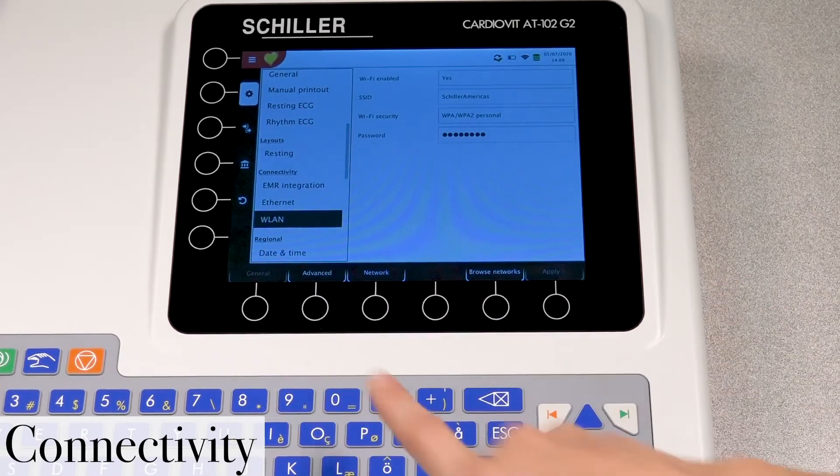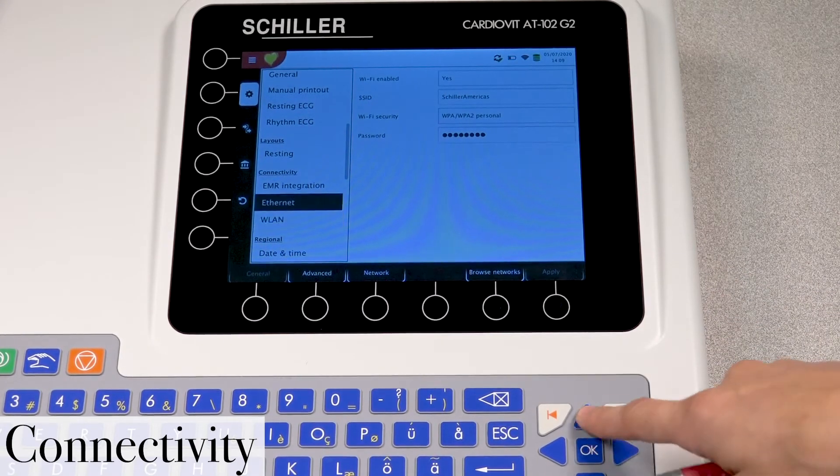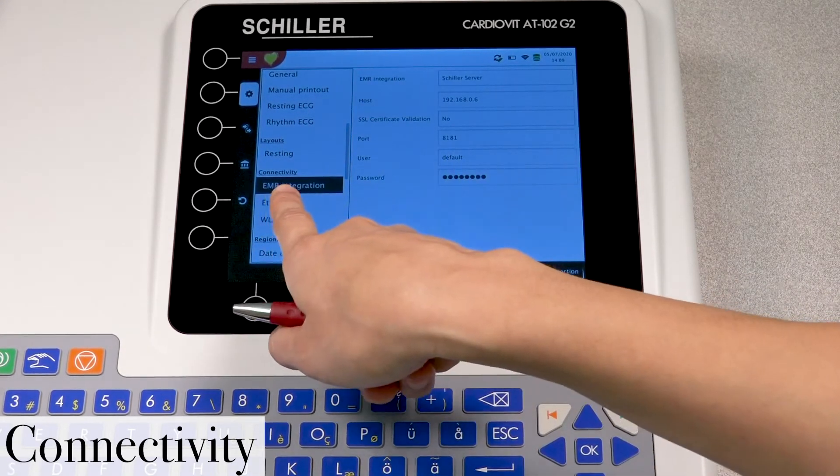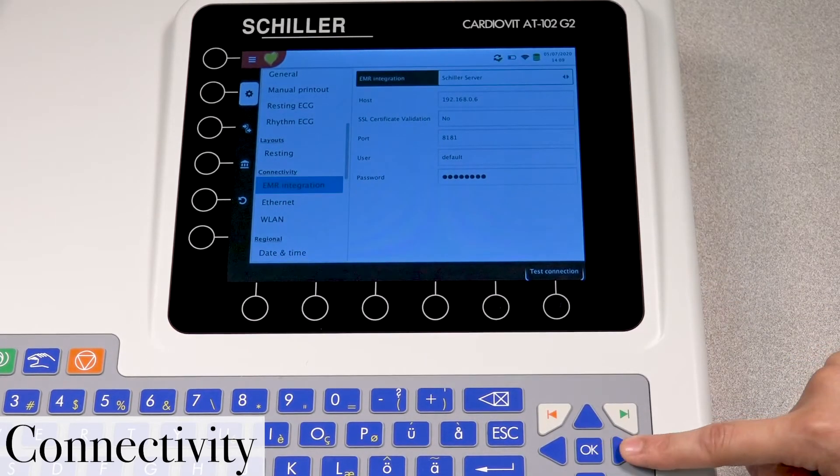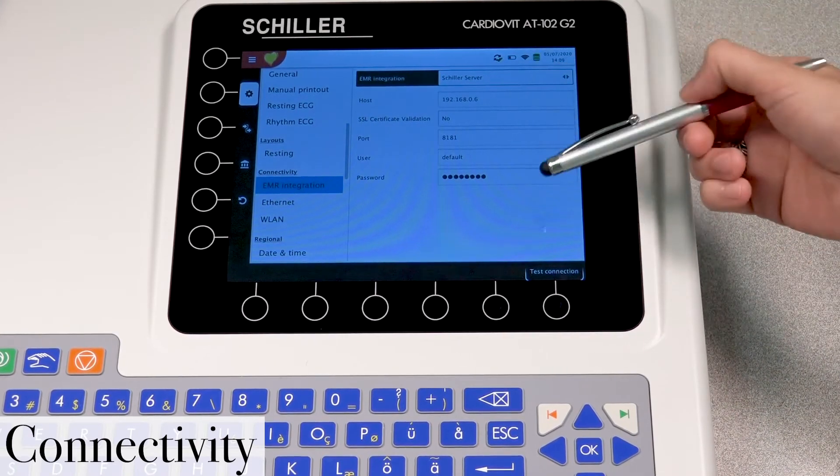Let's move back to the left side here. And with your up arrow key, go up to EMR integration. So we're going to go ahead and press OK. And now we're able to select the different fields here.